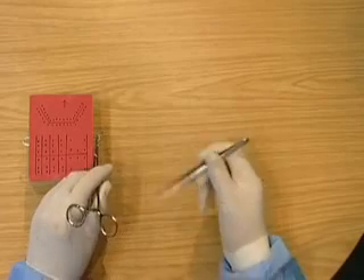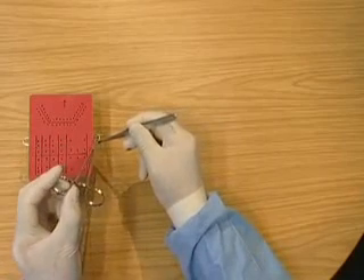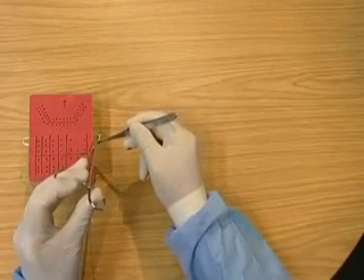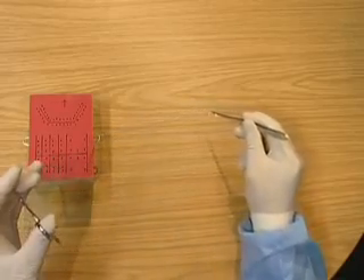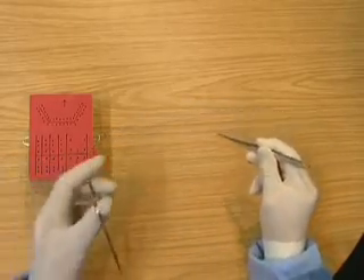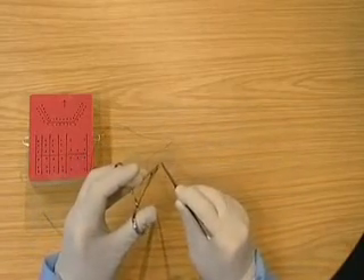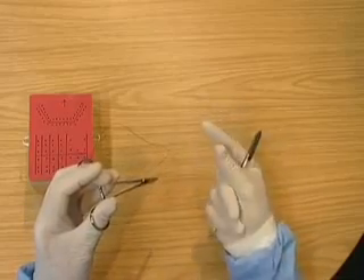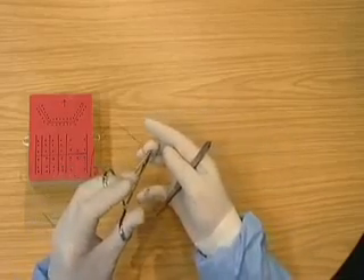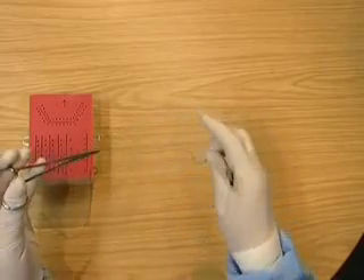Take the needle with the tissue pickups, unlocking the needle holders, pull the thread through, pass it back to the needle holders, parking the tissue pickups, putting the needle between the second finger and thumb.